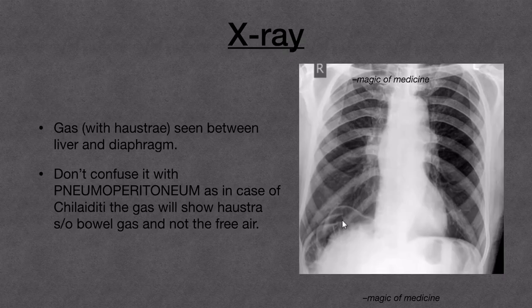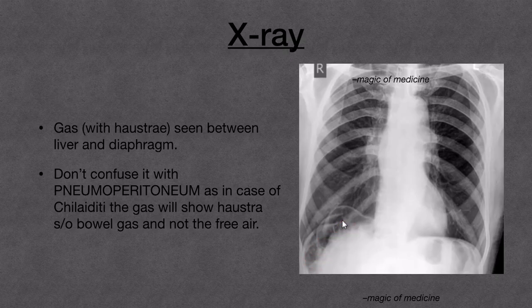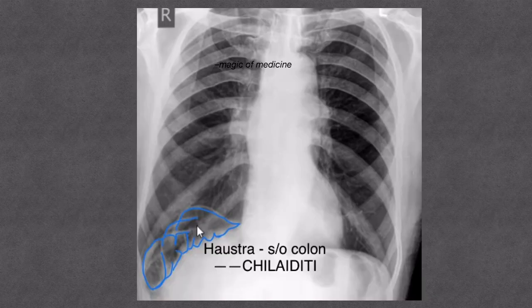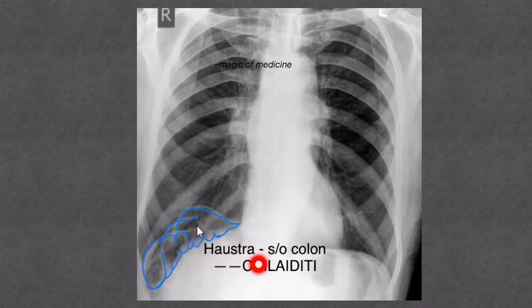Coming to the X-ray: most of the time Chilaiditi is an incidental finding noted on routine X-ray examinations. It will be seen as gas with haustrations between the liver and diaphragm. Here, this is the liver, this is the diaphragm, and here is the gas with haustrations — so it is Chilaiditi. Do not confuse it with pneumoperitoneum, because in Chilaiditi the gas will show haustrations suggestive of bowel gas and not free air, while in pneumoperitoneum there will be no haustrations and it will be clear gas under the diaphragm. The haustrations of the colon are suggestive of colonic gas and hence Chilaiditi, which also rules out the possibility of pneumoperitoneum. You can now confidently diagnose Chilaiditi from this.